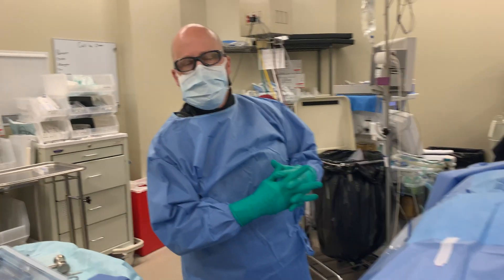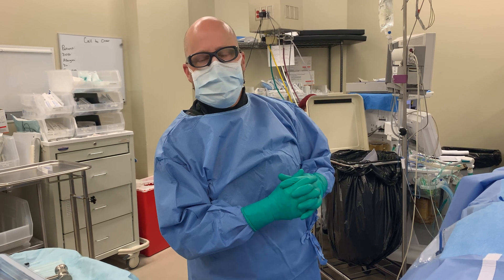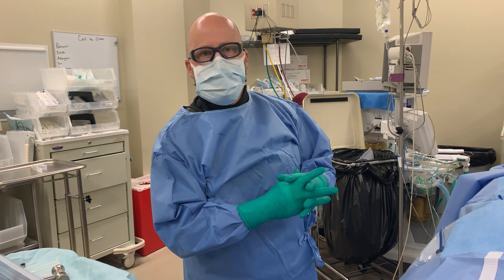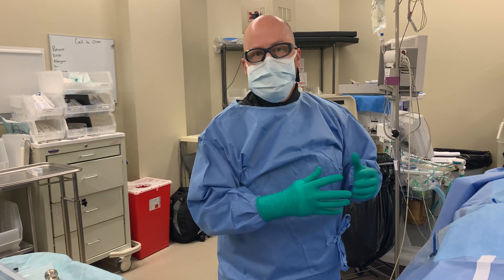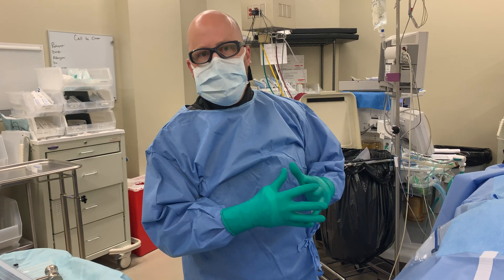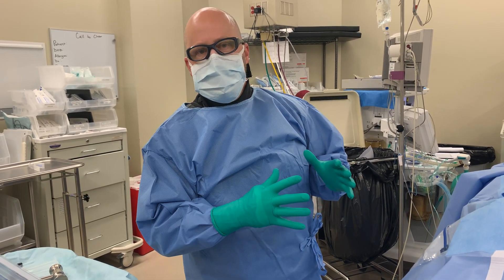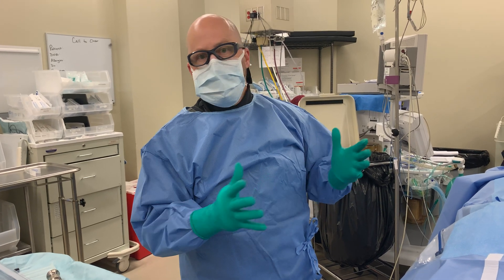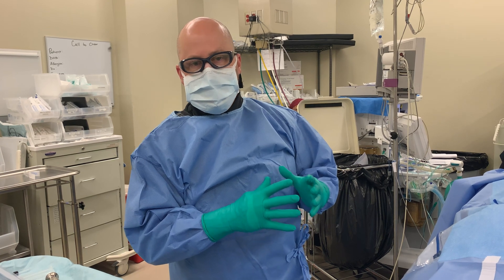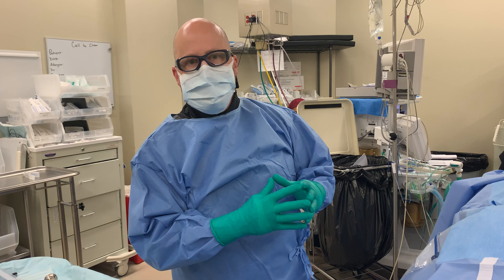Good morning. Today we're performing the intercept procedure for a patient with chronic low back pain. The procedure is indicated for patients with long-standing — greater than six months — of low back pain without neuropathic pain radiating into the lower extremities. It is a procedure designed to destroy the nerve supply within the vertebral body where it meets the intervertebral disc, at the anatomical structure we refer to as the end plate.